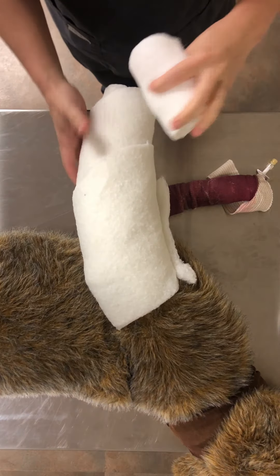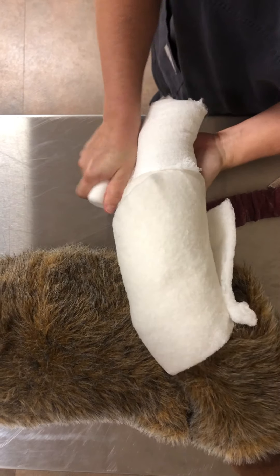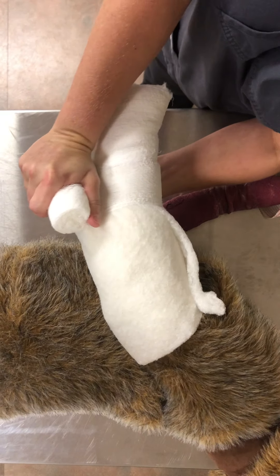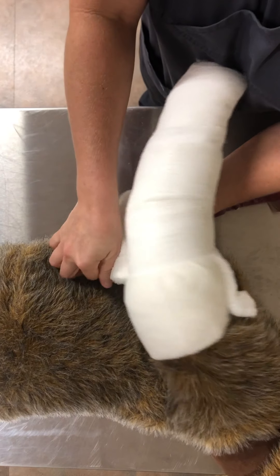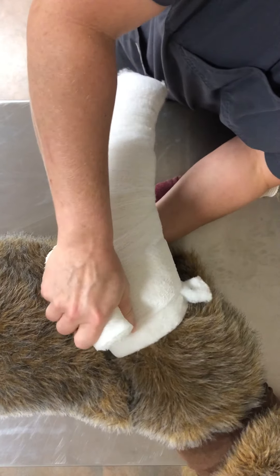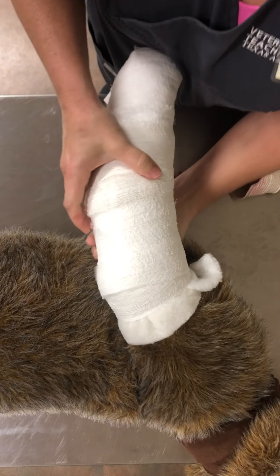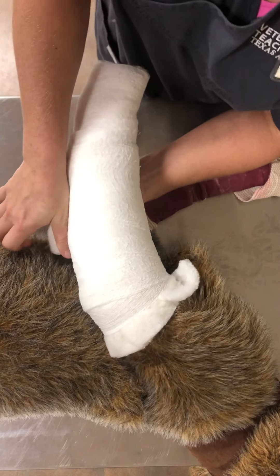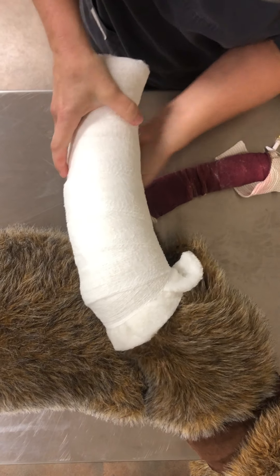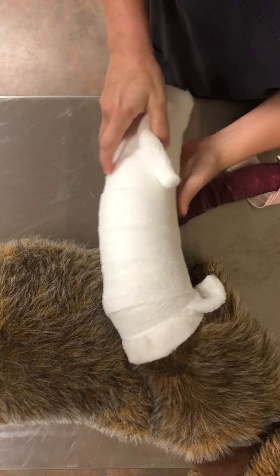Now that we have a nice, thick, evenly padded layer, we're going to start with our stretch gauze. There are multiple types of stretch gauze. You want to make sure you pull evenly — I recommend holding your roll to tighten, which gives you leverage because you're going to be tightening it quite a bit. Grab the limb, grab the roll, and pull very snug. It's very important that this layer is even — all the tension should be the same from the bottom where the feet are to the top above the elbow. Patients are more comfortable with an evenly compressed bandage.